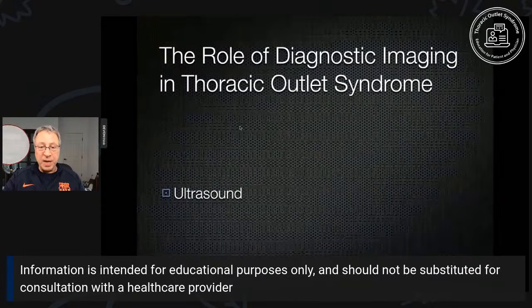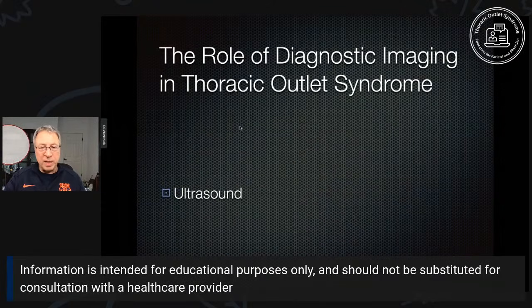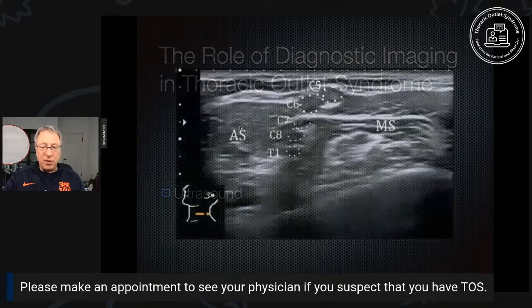Let's move on to ultrasound. Many of you may have had ultrasound. We know pregnant ladies get it. We know people with blood clots in their legs get it. Ultrasound is a pretty widely used test. It doesn't work with X-rays, so it doesn't provide radiation.